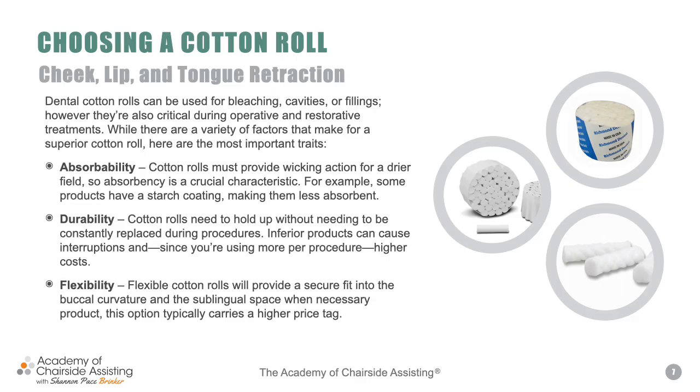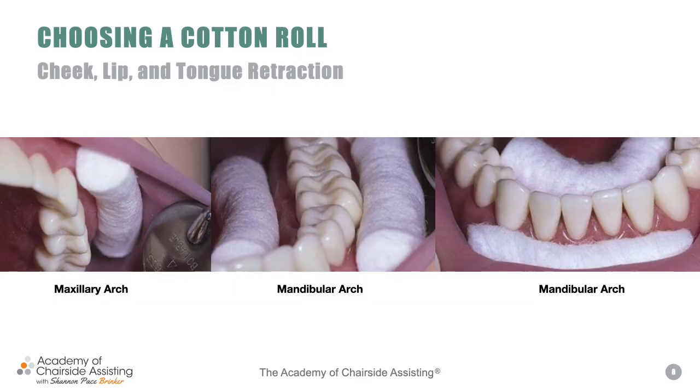Sometimes, again, as we're going to talk about later on in this module, is exactly where they are going to be placed. So let's talk about that just for a little bit. On the maxillary arch, we talked about going in between the cheek. The doctor will pull out the cheek, and we're going to place that right in. And as a new assistant, you may not feel comfortable yet just placing those, so the doctor sometimes will do it, or will hand the cotton roll to the dentist on a cotton plier and pass that to the doctor.